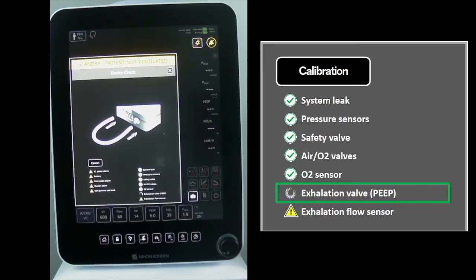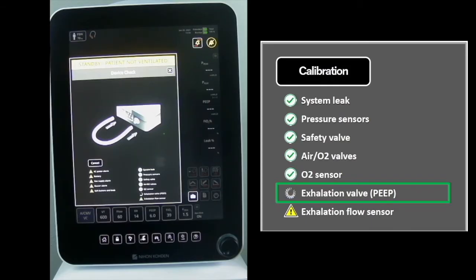Pressure will be ramped up to 110 cm of water, then returned to zero in a triangular shape. P2 must be under 1 cm of water at the end of the stage.